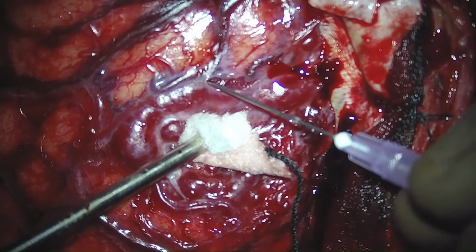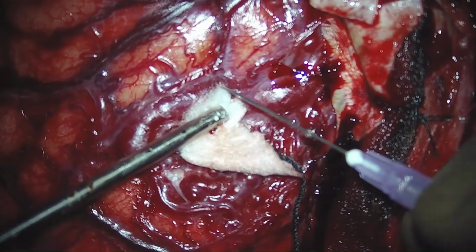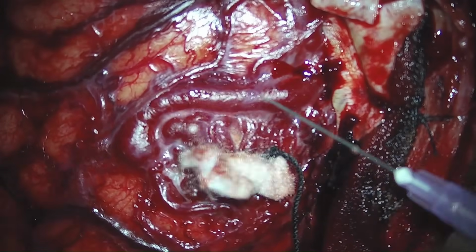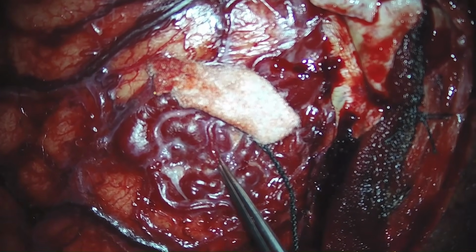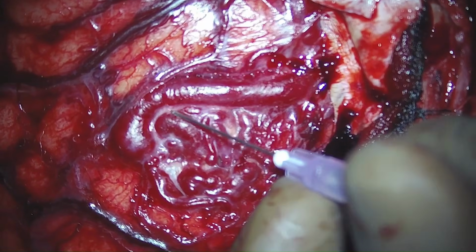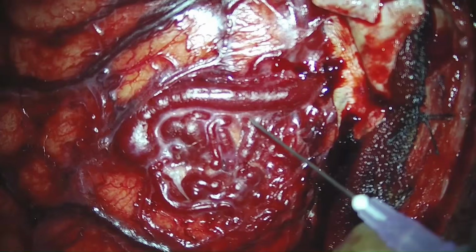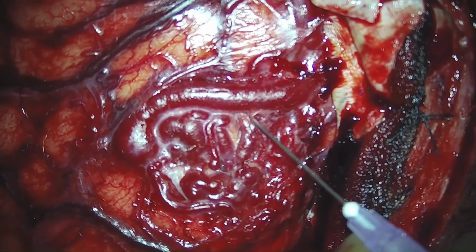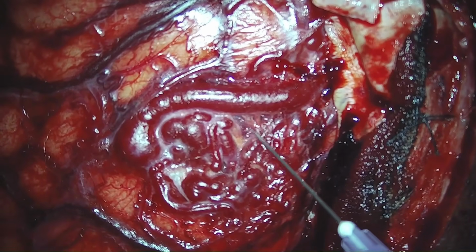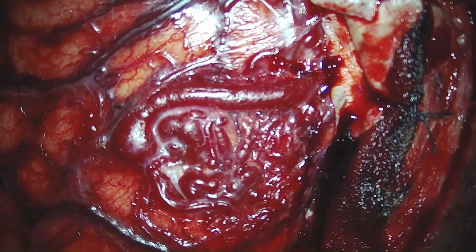After that, we checked for the fundus of the aneurysm, and we found that there is a good clipping through and through. So we started proceeding for dissection of the AVM. Left parietal AVM had its feeders from the same callosomarginal artery where there is the aneurysm, and MCA vessels were feeding along with a part of posterior circulation with the PCA branch feeding the AVM, and it was draining into the superior sagittal sinus, and that AVM is also very close to the superior sagittal sinus.